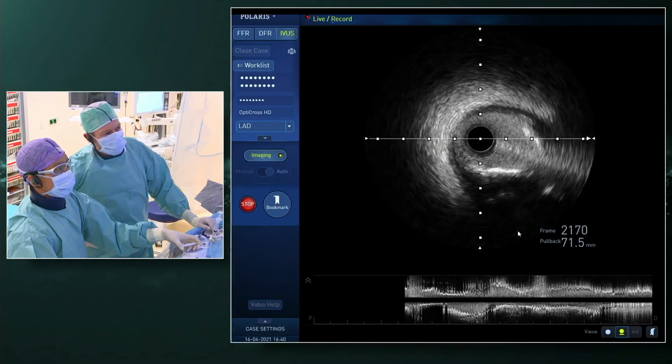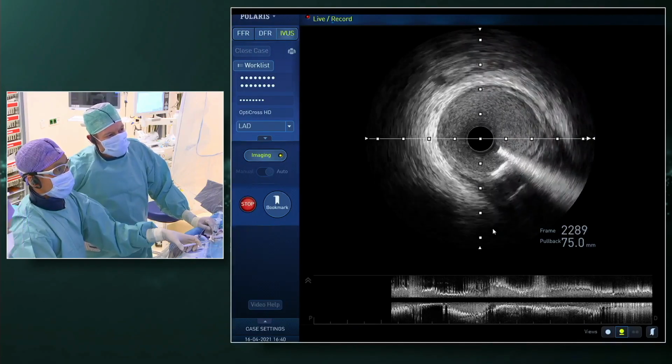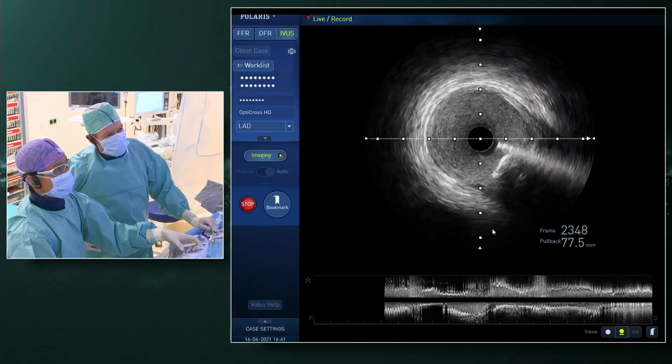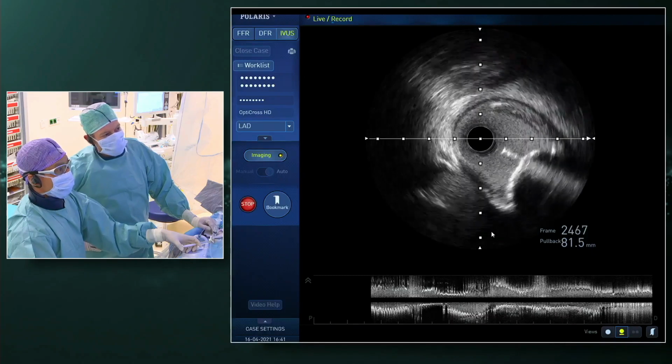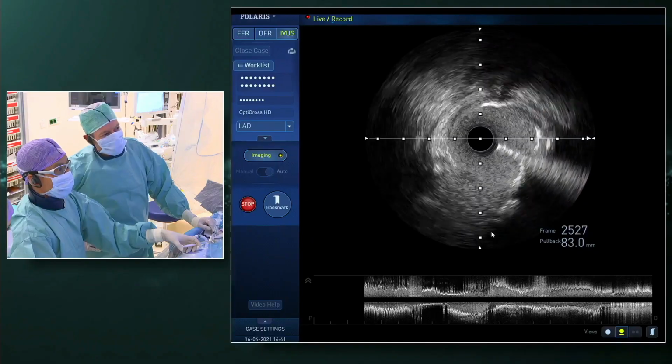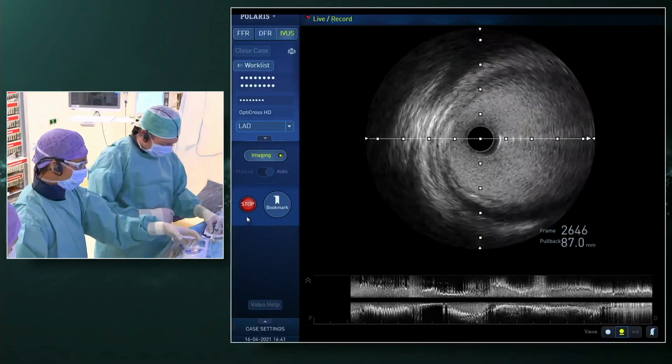So I'm happy because actually that's the only thing we wanted to achieve, to generate some cracks here and there. And the good thing is that there are no large hematomas, at least non-extending here. And that's great, and that's we are in the left main. So I'm actually very happy.